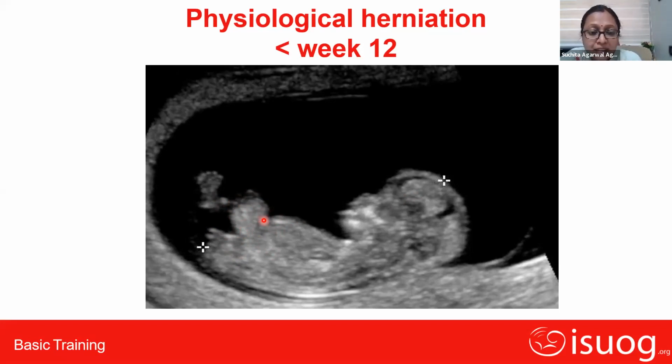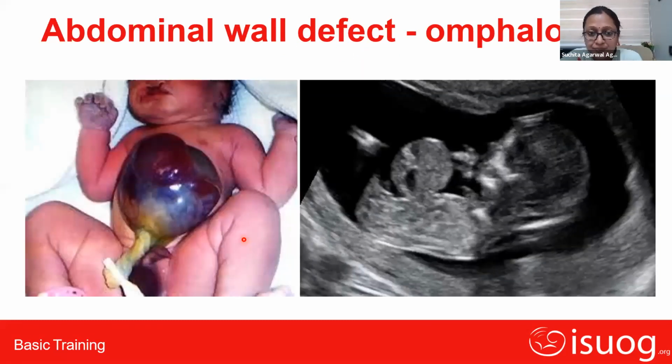In almost all cases, spontaneous resolution has occurred. So do not push the panic button when you see this in the 11-week scan.